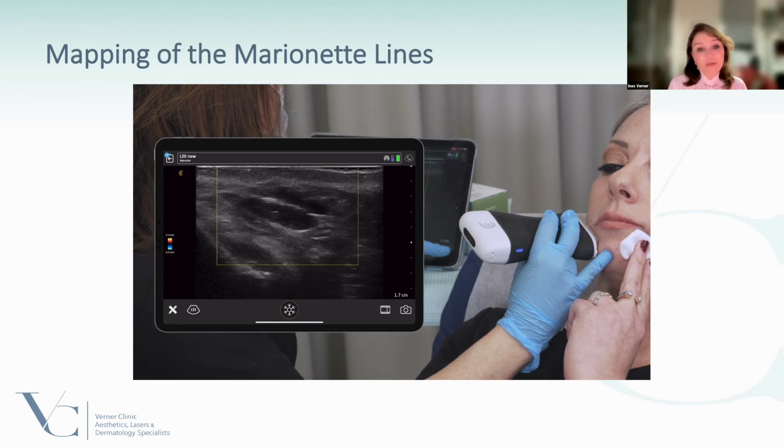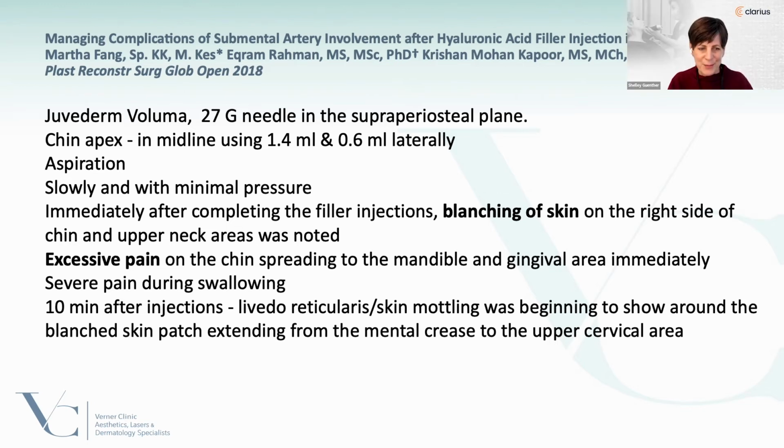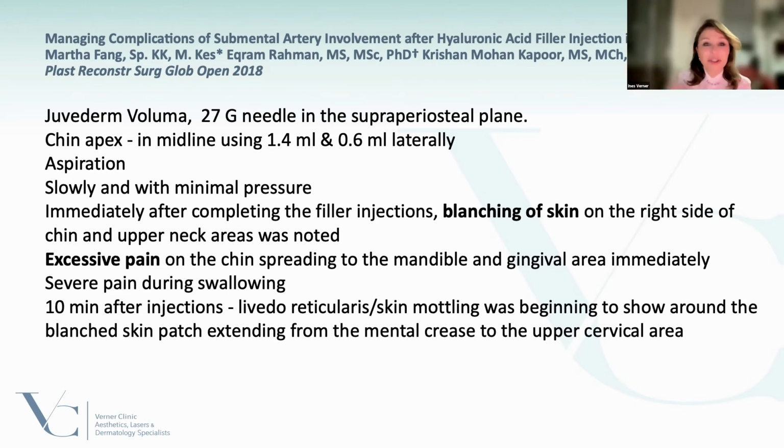I have to say that yes, of course, you can do this ultrasound after the injection just to be even more safe. But if a patient is in the clinic and they have nothing, no blanching, no skin changes or no discoloration after the injection, then of course the chance that you've hit something is nearly zero. So this is very, very safe. But you can visualize just to see that the vessels are pulsating, and so everything is good. It's an added reassurance, which is very, very nice.